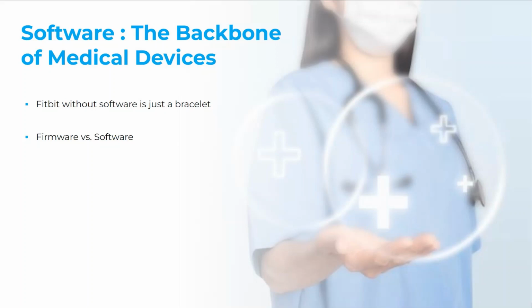And software is the backbone of medical devices. When we talk about hardware medical devices, take a Fitbit. If your Fitbit doesn't have software, it's just a bracelet. It's not telling you steps, it's not telling you time. The health part of it is that it checks your heart rate. It's always monitoring your heart rate.